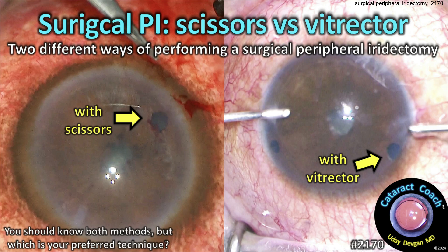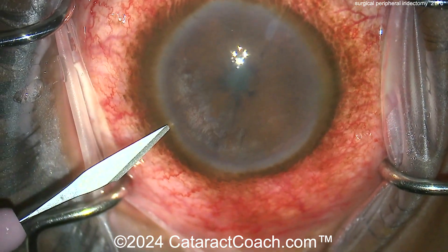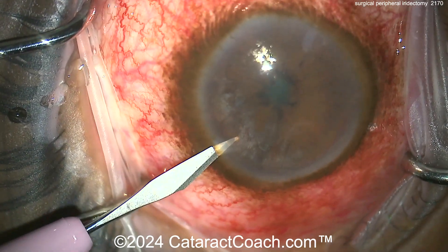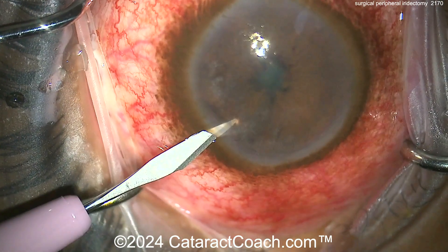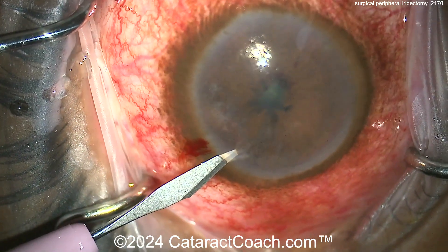cataractcoach.com — surgical pi scissors versus the vitrector, two different ways of performing a surgical peripheral iridectomy. This patient has some closed-angle glaucoma — what an angry red eye. Unable to get a laser peripheral iridotomy, the surgeon is taking the patient to the operating room. A pair of incisions is being made.